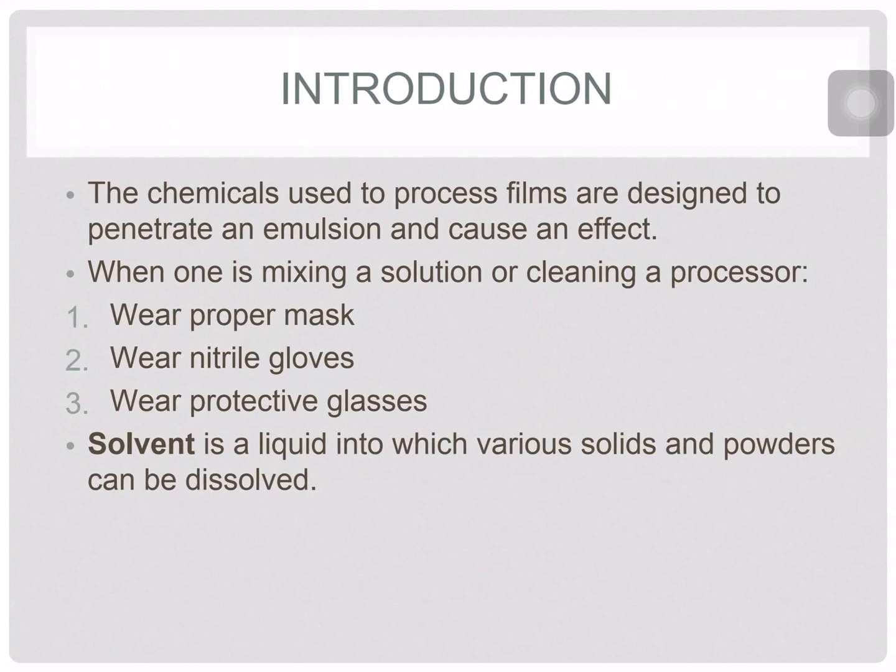Okay? So, kapag ang isang radiographer, ang isang rad tech ay nagtimpla ng solution, ano yung mga dapat gawin? Siyempre, the radiographer should wear proper mask to prevent inhalation of chemical fumes that can cause an effect to a human. And then, he or she should wear nitrile gloves para maiwasan ng allergic reactions kapag napadaw-daw or napalaga yung kamay sa ating solution. And also, he or she should wear a protective glass to prevent splashes of chemical solutions sa eyes ng ating rad tech.